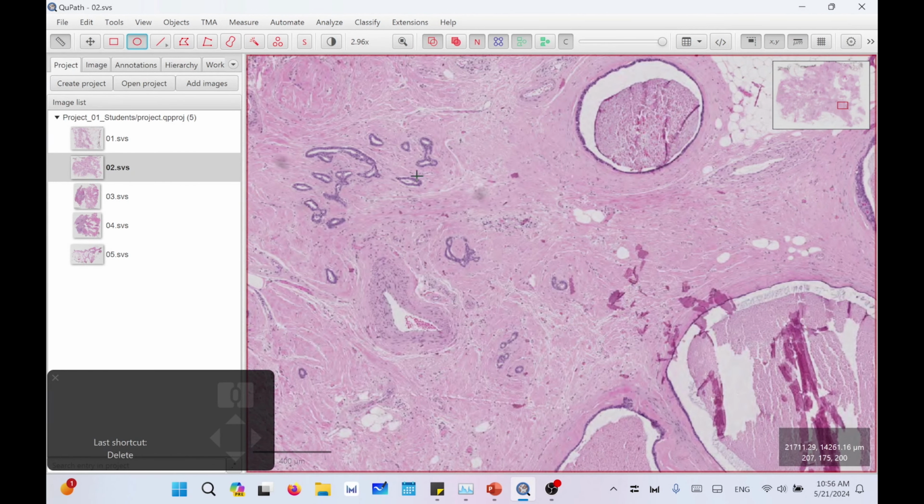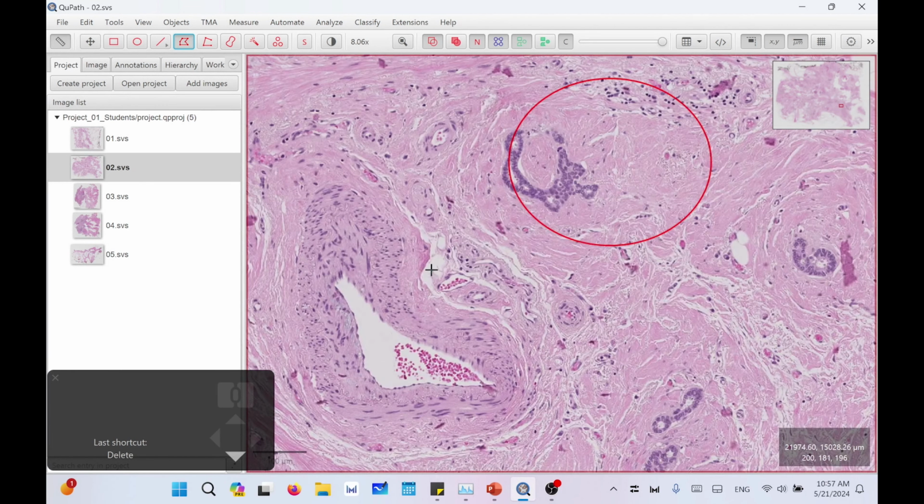You can also use the oval or ellipse. You can draw a line. You can draw a polygon, and polygon here can be performed in two ways. You can put points and it will connect them using lines. For example, you press a point here, another point here, another here, and so on. As you see here, it draws a polygon. Once you are clicking, it will connect lines.